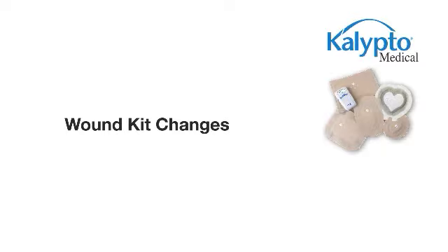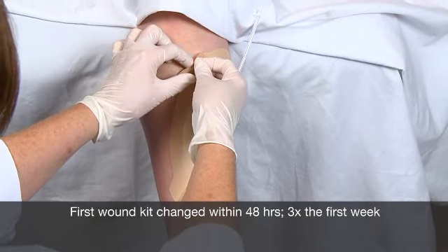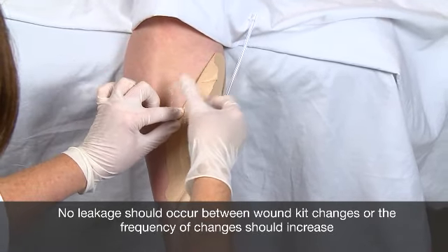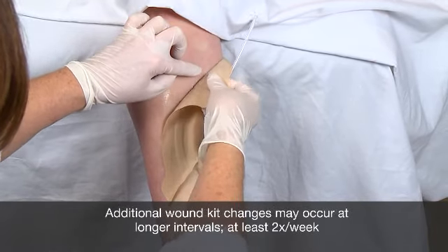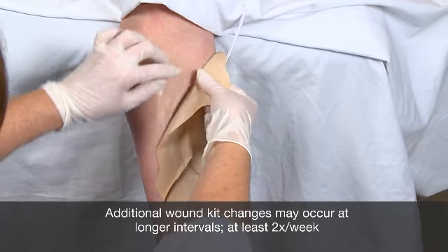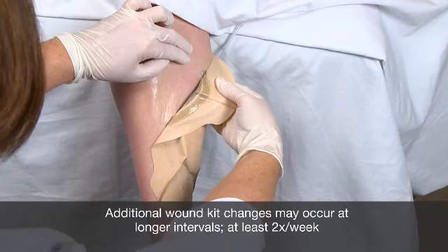When first starting a patient on Calypto Medical's negative pressure wound therapy, the wound kit should be changed within 48 hours. If there is a lot of drainage, you may want to check the wound kit sooner to prevent oversaturation. Subsequent wound kit changes may occur at longer intervals if the drainage is contained and the seal is maintained. However, wound kits should be changed at least twice a week.